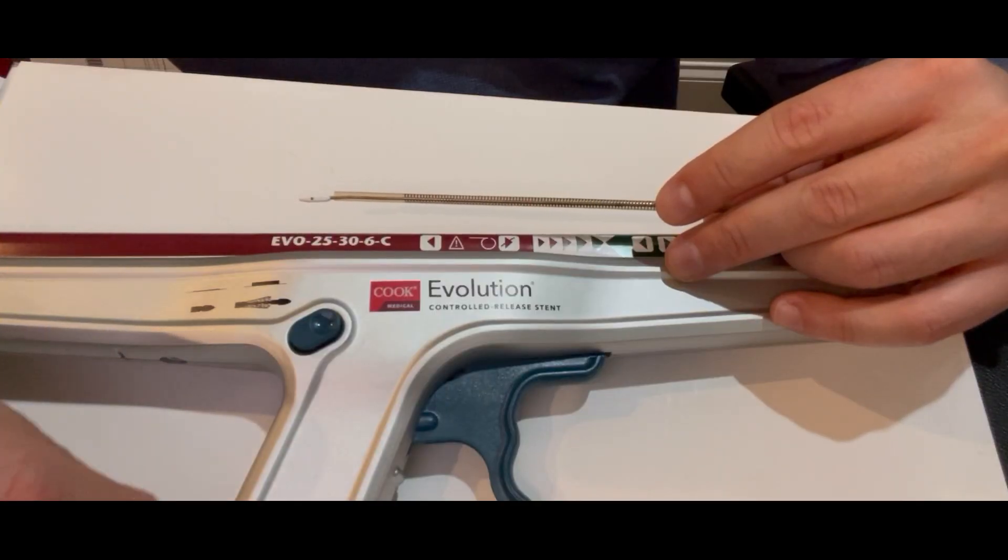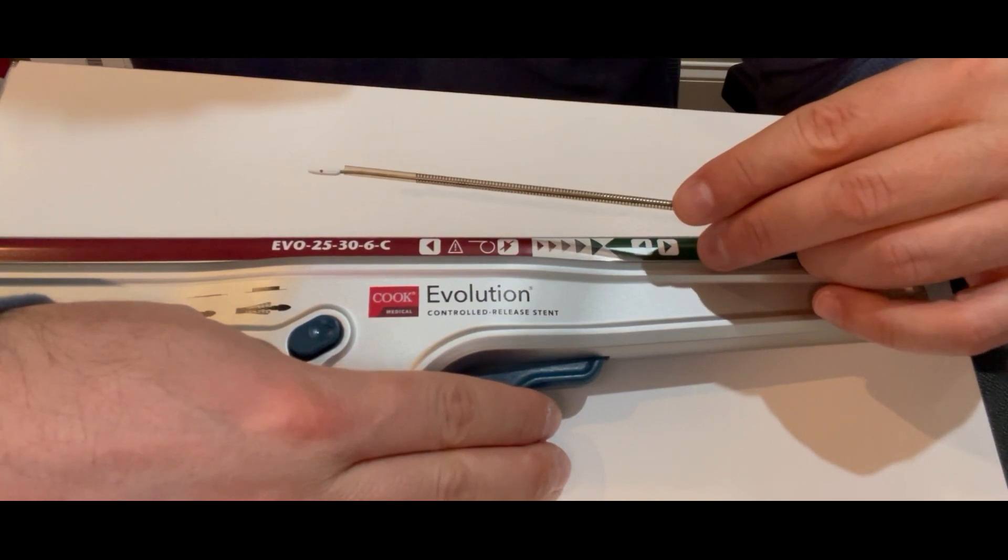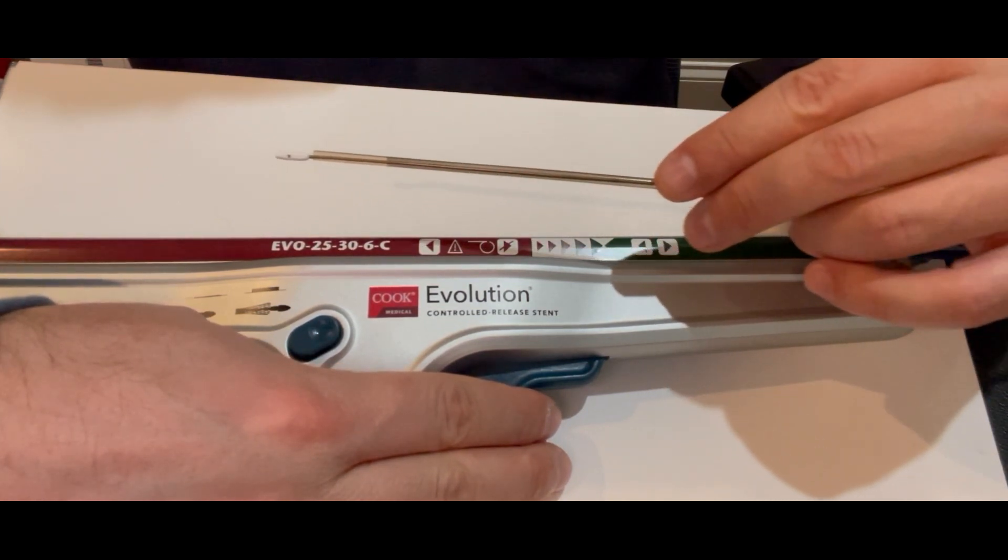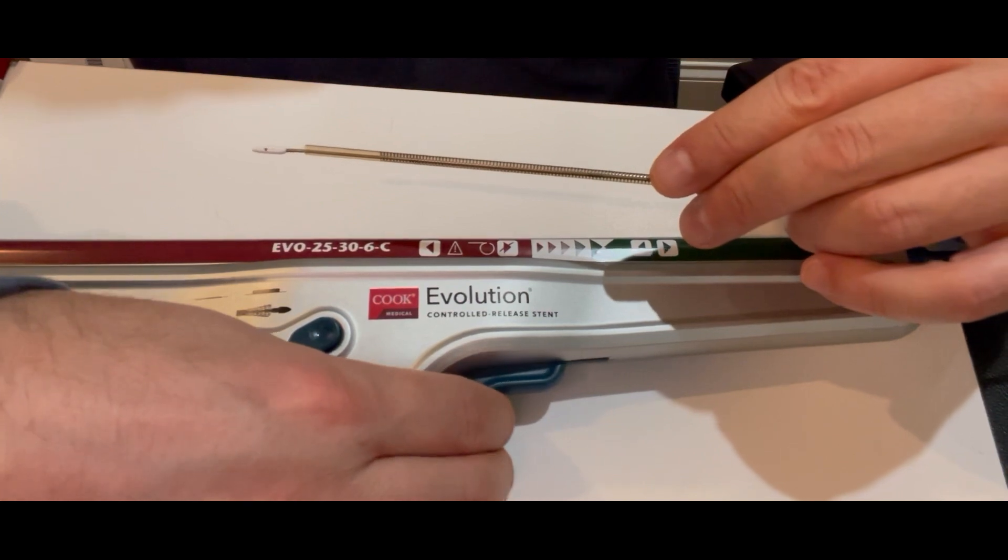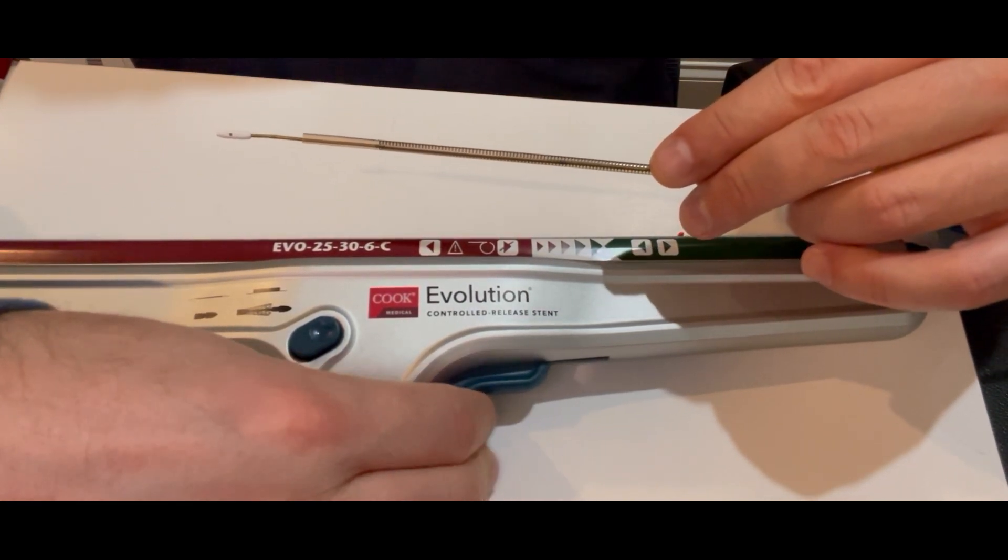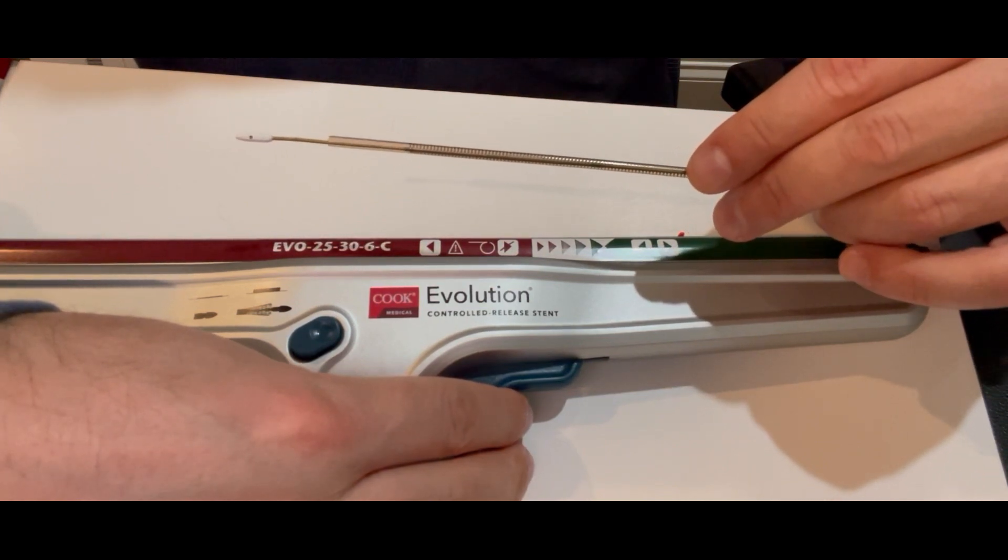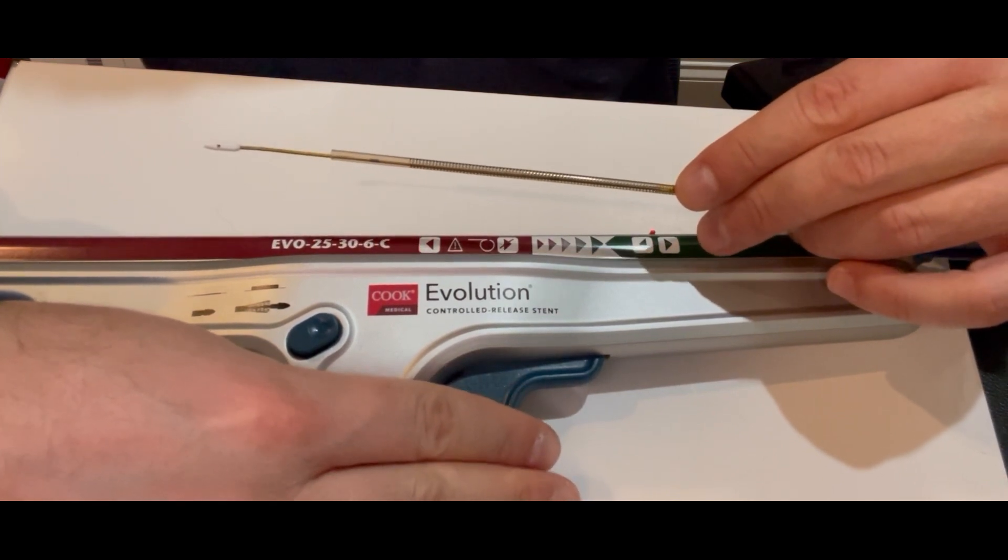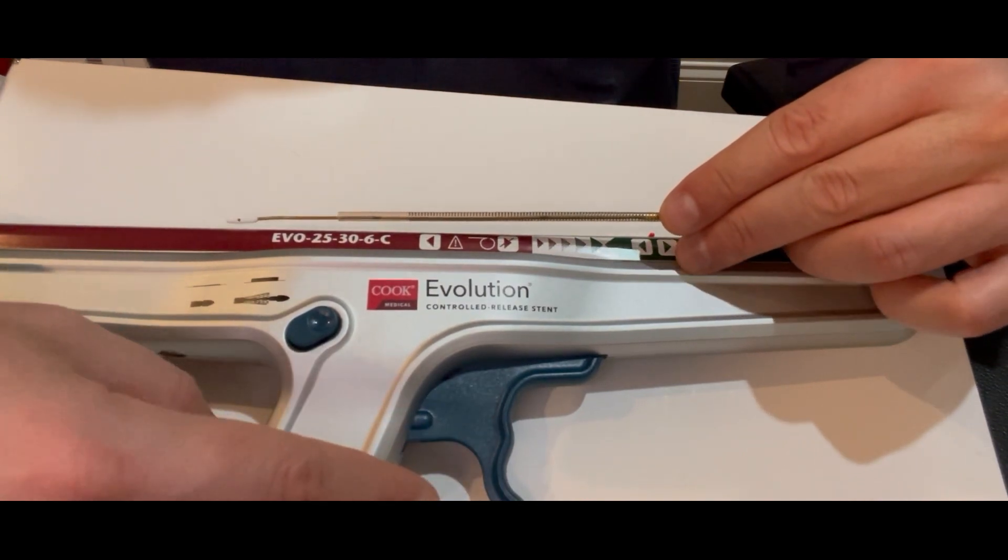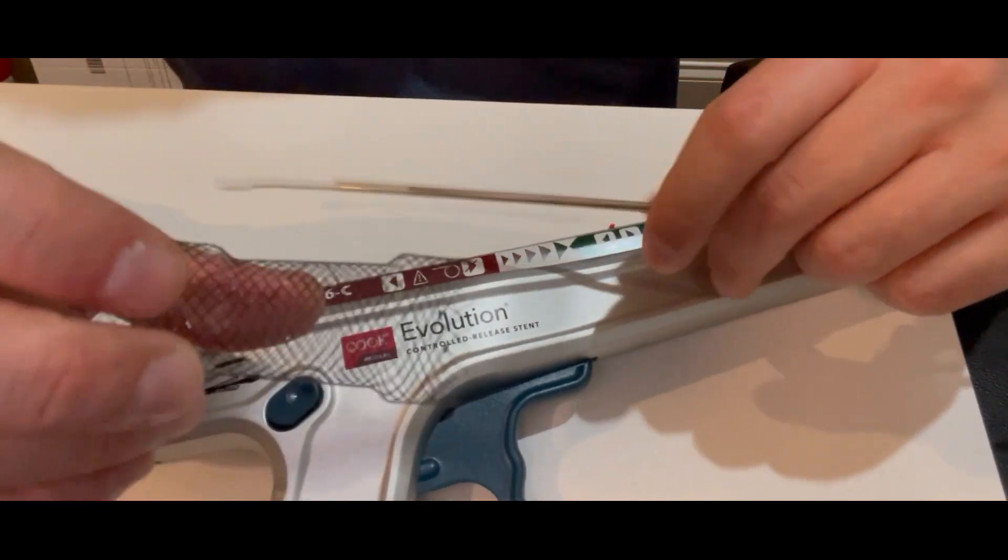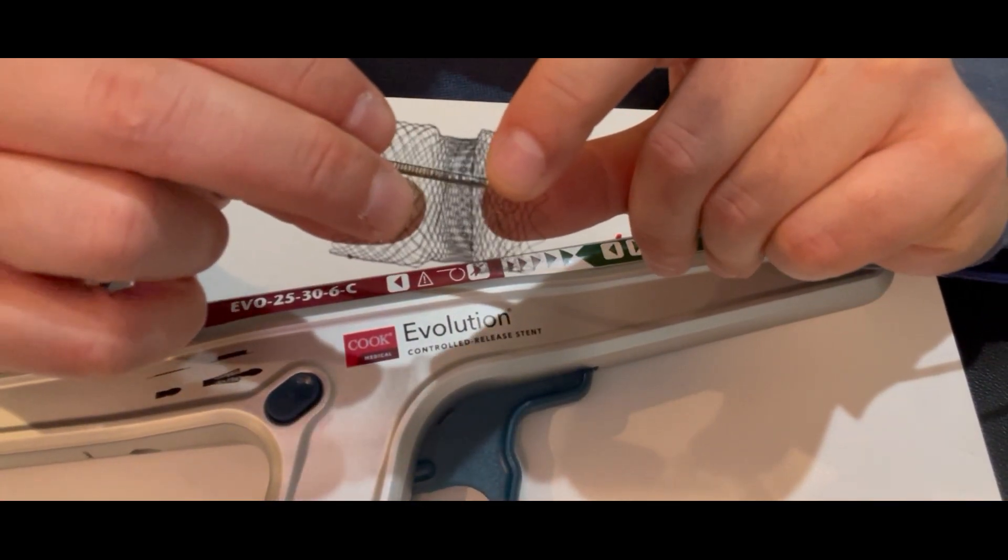One of the nice features I like about this system is you can adjust how long the stent is by pushing on the system while deploying versus releasing. If you push hard while deploying, you're stacking the stent struts close to each other. If you release and let it deploy, it will deploy in a much longer fashion. This allows you to customize it depending on the patient's anatomy.